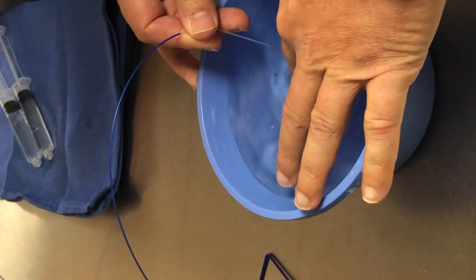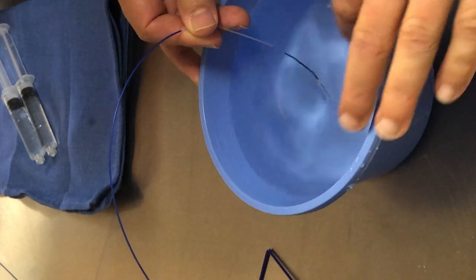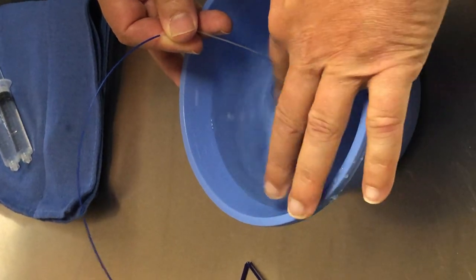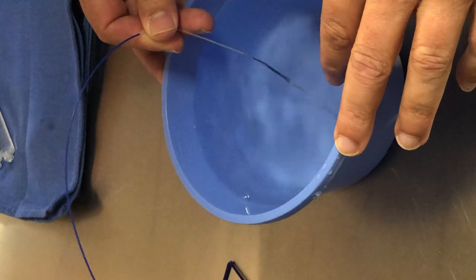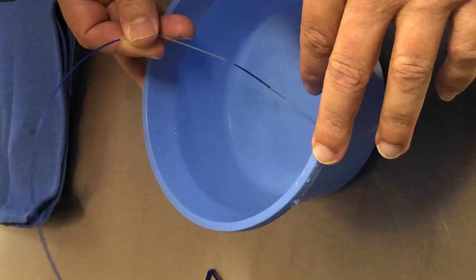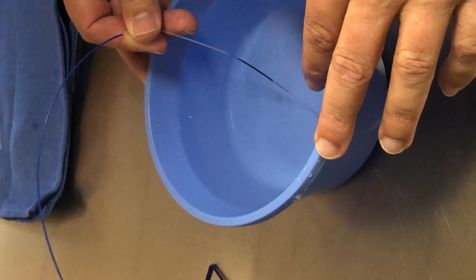You can see those little air bubbles coming out. You might have to readjust the torque device, just slide it up a little bit to give yourself a little bit more tension.